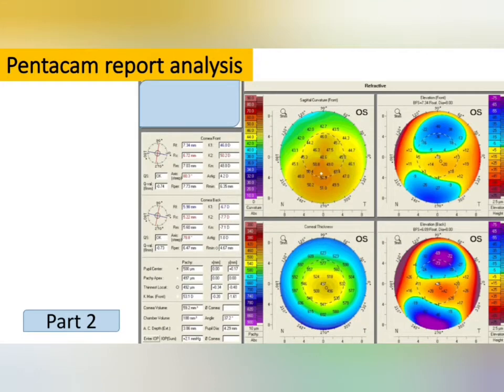Hello everyone, welcome to my new video. This video is a continuation of the Pentacam video I made previously. In my last video I first told you about the normal values and correlated them with different types of cases. In this video we are only going to look at different cases and see whether they are normal or abnormal.